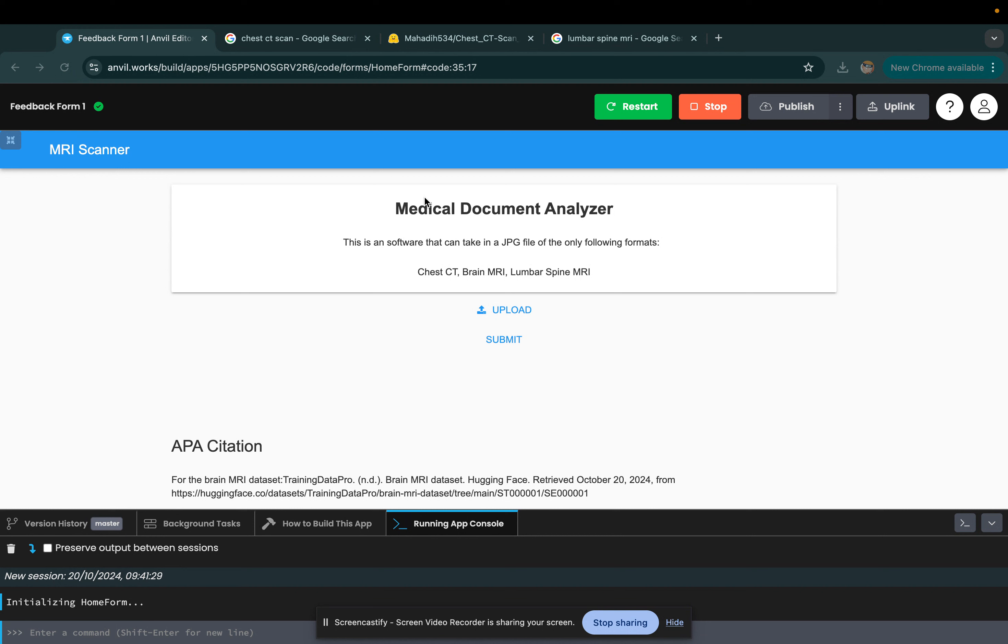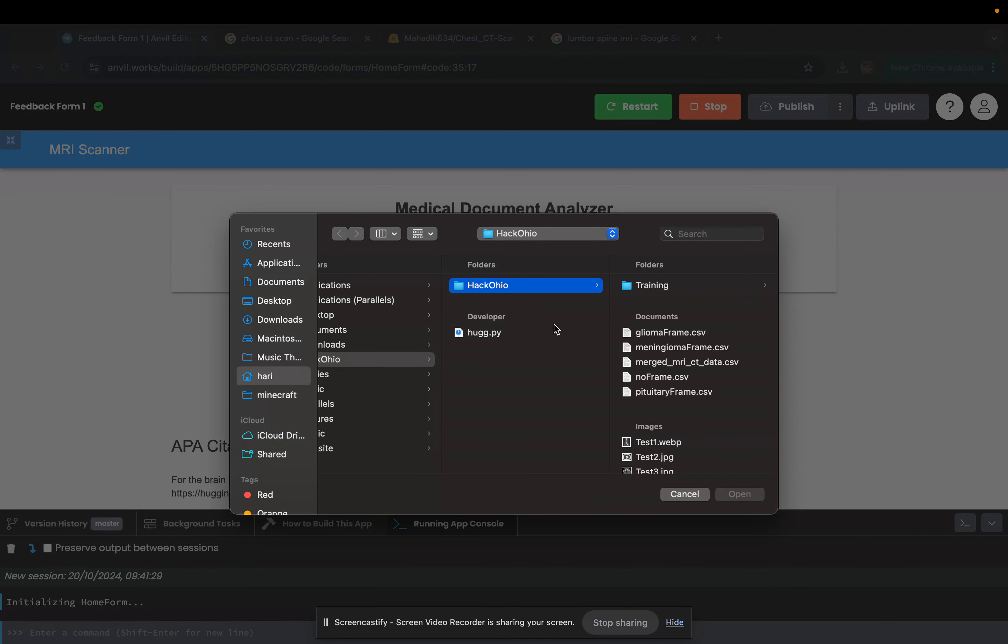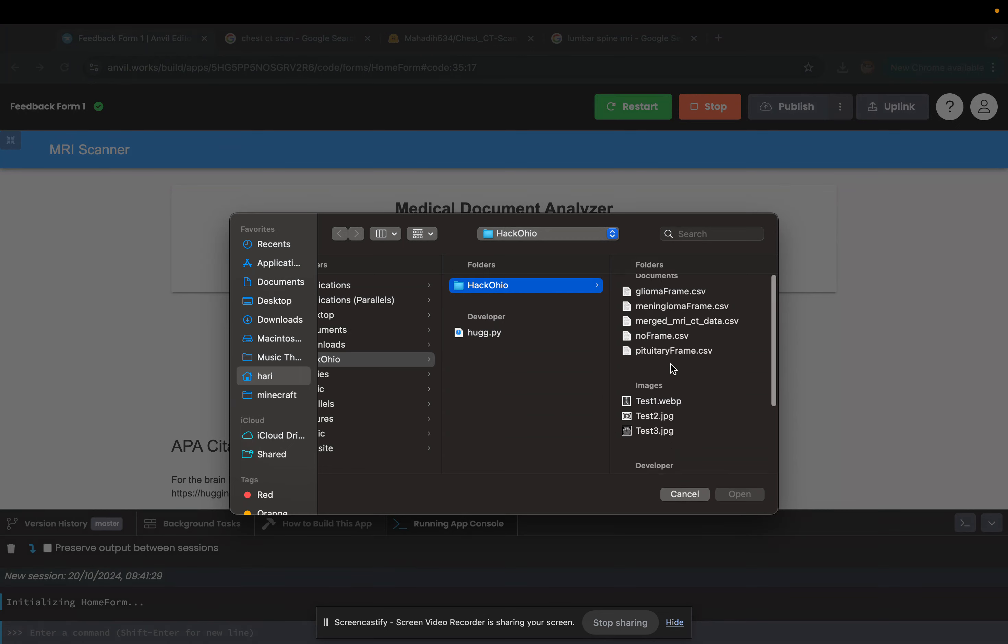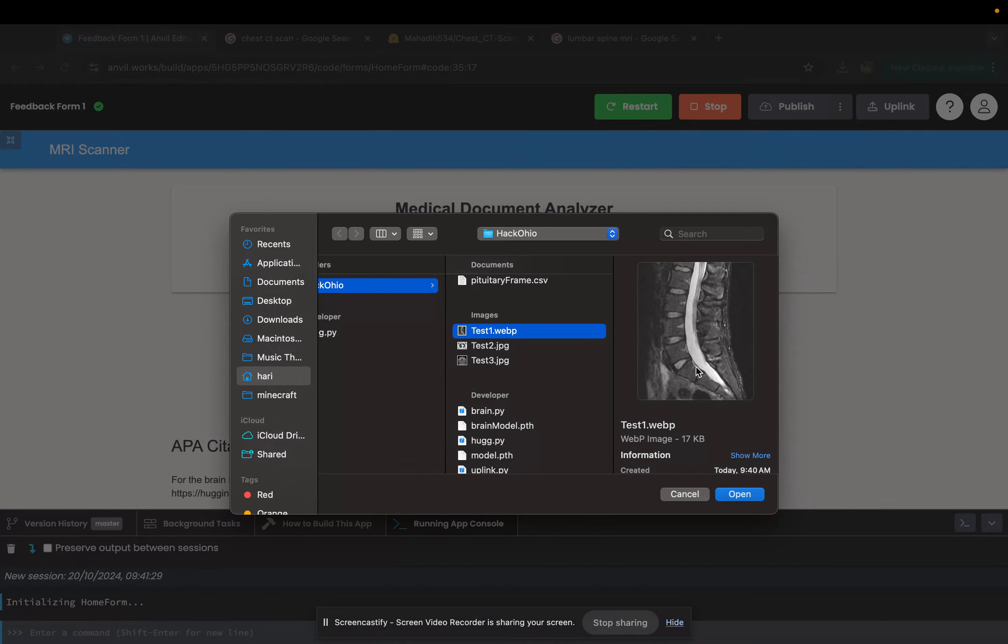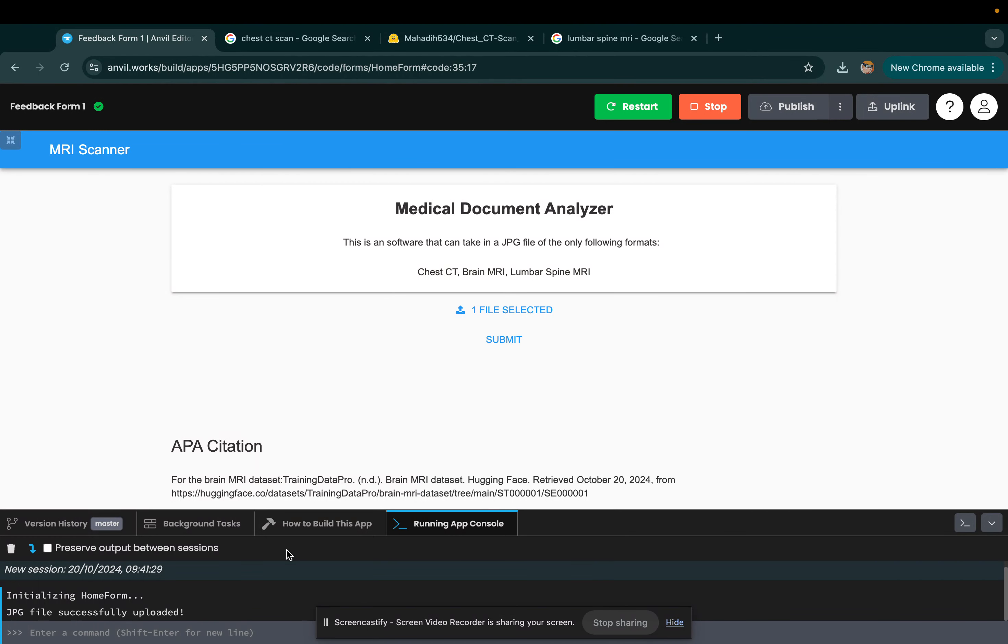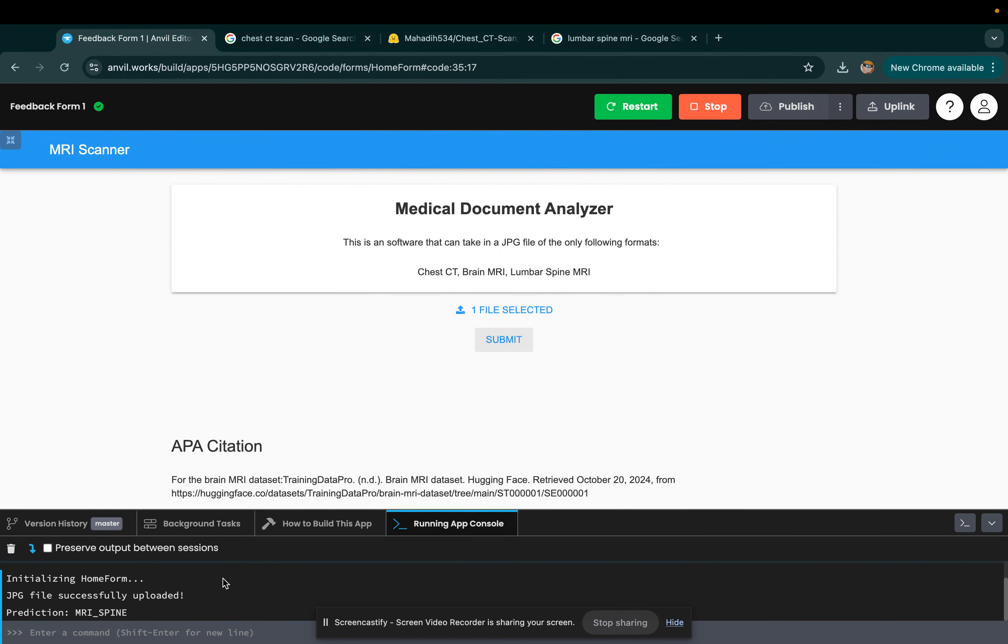You can upload a file here, as you can see. I have a couple test images of patient scans. Here we have a spinal MRI, and we upload it. Then we submit it, and prediction: MRI spine.